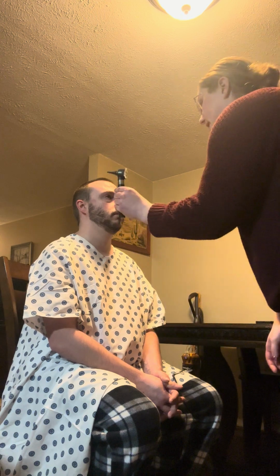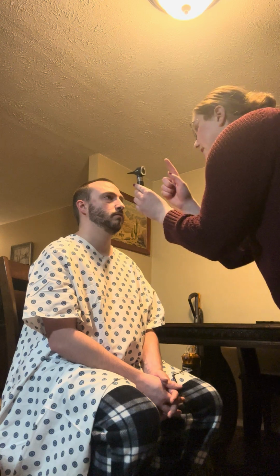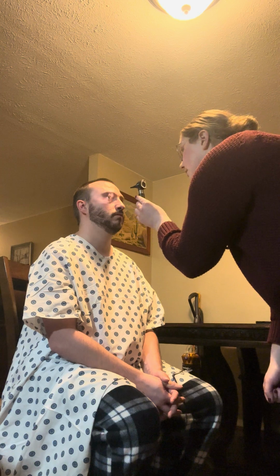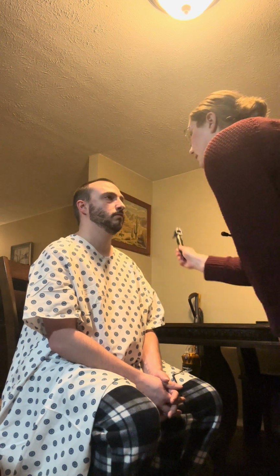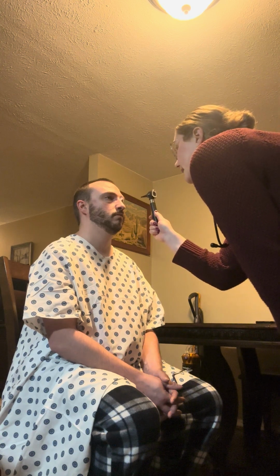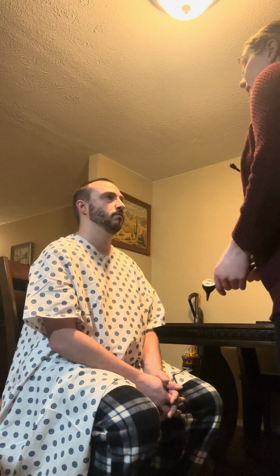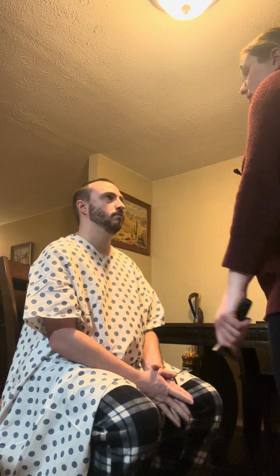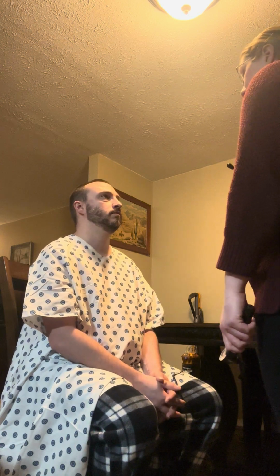So I'm going to have you look straight into my face here. And I'm going to shine a light, but I'm going to be shining the light into the right eye, but looking for the consensual response on the left. Okay, and the left eye did constrict as well. And I'm going to do the same thing to shine a light on the left side and look at the right eye. And that constricted as well. So the consensual light and the direct light response were intact and symmetric and equal bilaterally. So the cranial nerve number 2 is intact.